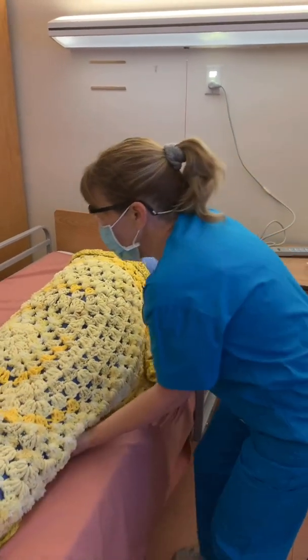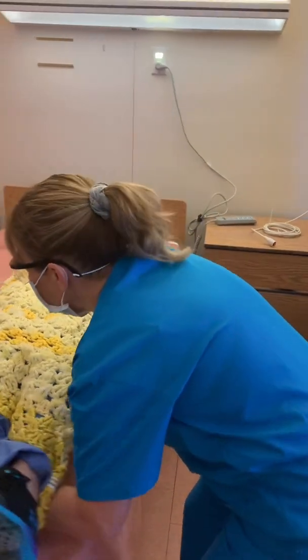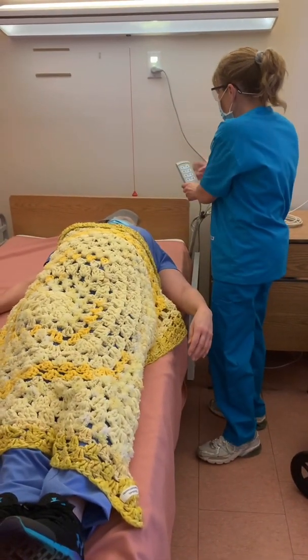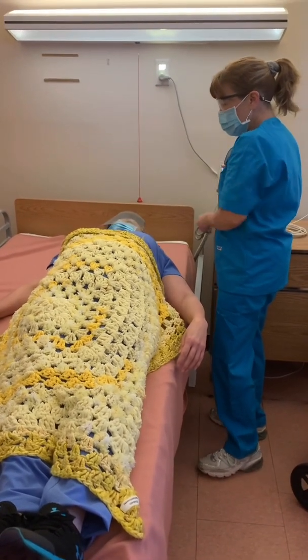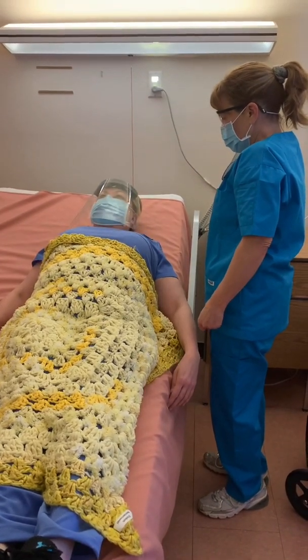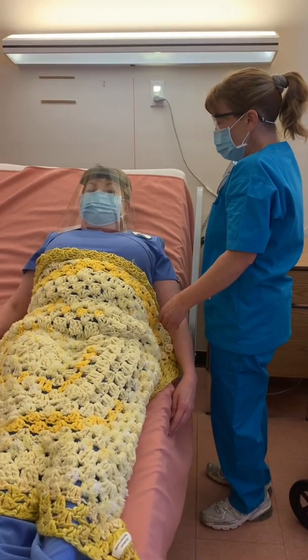Okay, I'm going to just move this part down a little bit. And then I'm going to move your legs closer. I see you have your shoes on already, which is great. So now I'm going to lift the bed, if it's okay with you, to the high Fowler's position so that we can help you sit up properly. How are you? Comfortable? Yes.